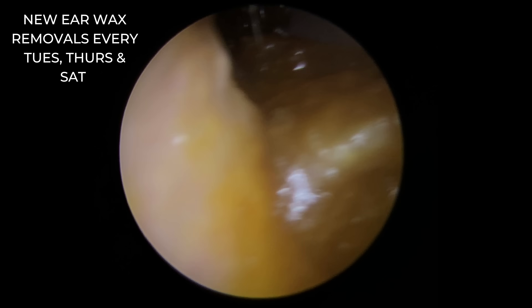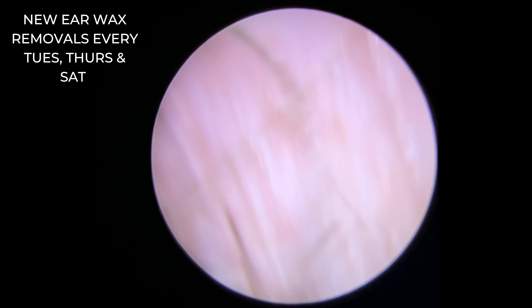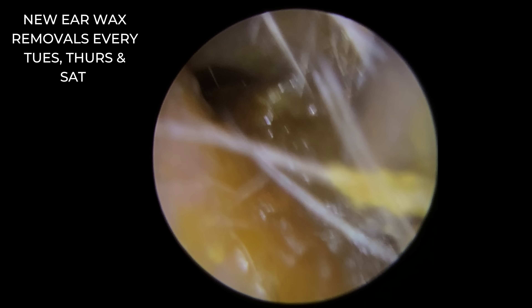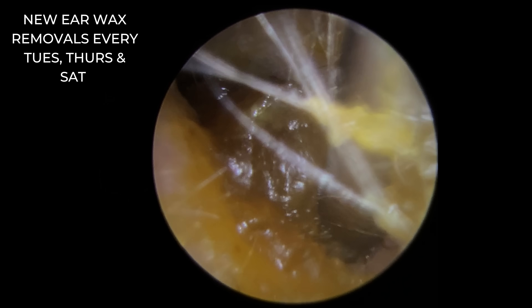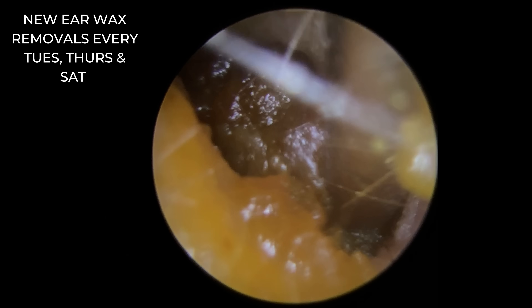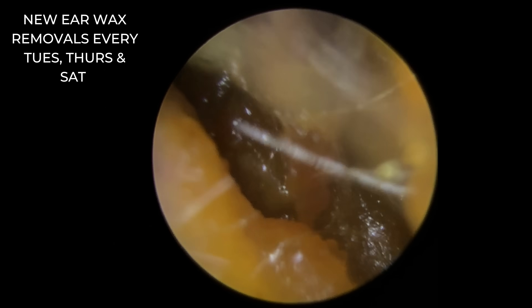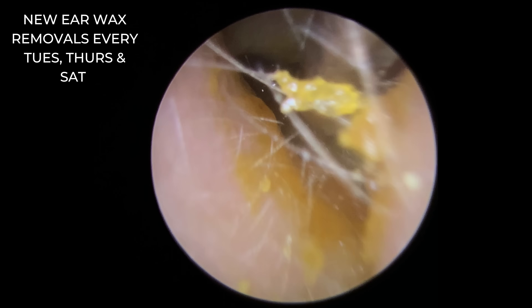The blood vessels you can see there on the canal walls. It's not unusual — it doesn't necessarily mean that the patient has had an ear infection. Sometimes the skin can get a little bit aggravated in there, especially with wax rubbing back and forth. The blood vessels are very, very close to the surface of the skin, and the skin is very, very thin. So sometimes you will see these blood vessels coming to the surface, and the same can happen sometimes on the eardrum as well.